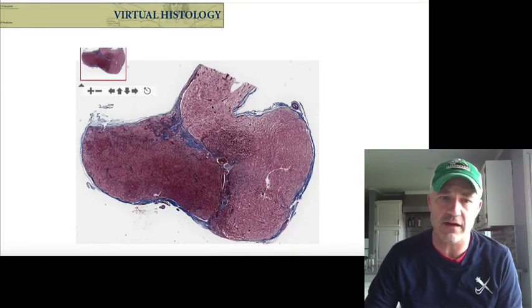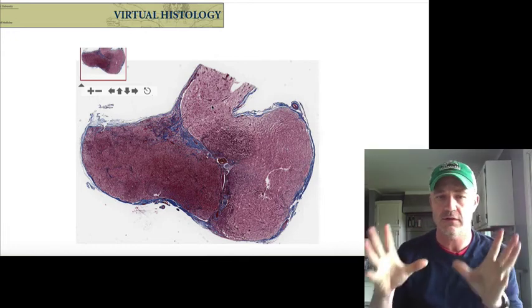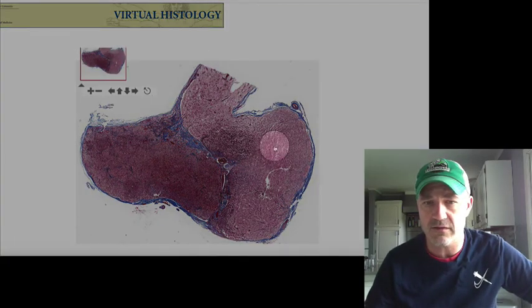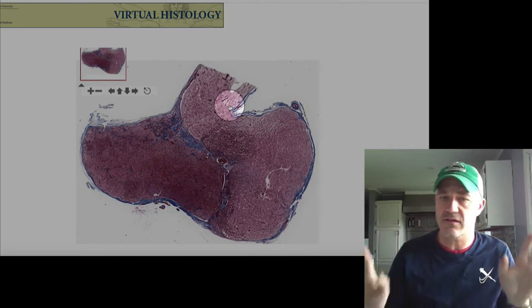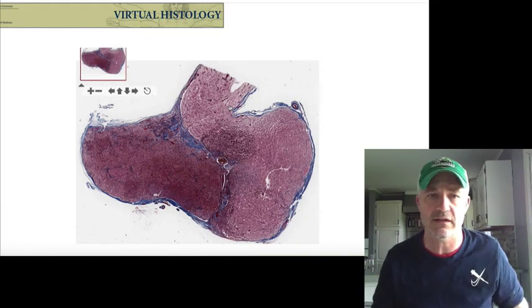I figured I could try to find one more slide on one of the other slide boxes that maybe would show you the overall pituitary structure a little bit better. This one kind of does that. So you can see here, this would be that pars nervosa and the infundibulum going up this side right here. Here's the pars distalis. You can see the blue is kind of making up that pars intermedia. Pars tuberalis is this part going up right along the side here. Again, just giving you a little better look at the overall pituitary gland structure.